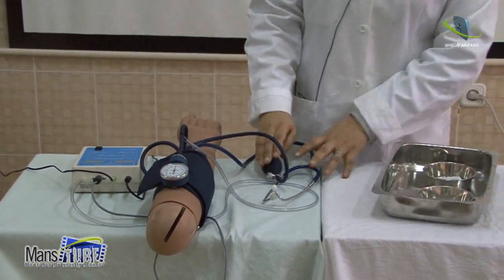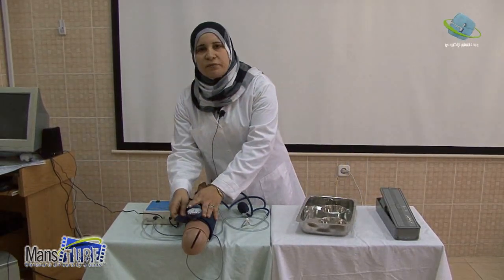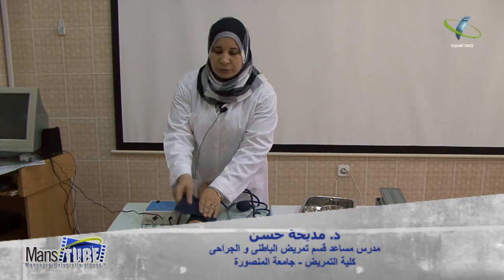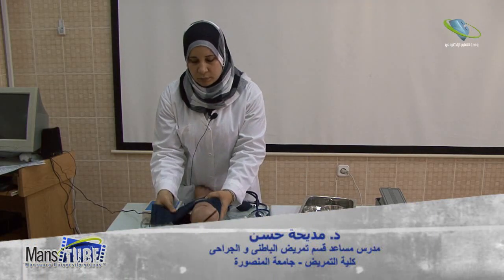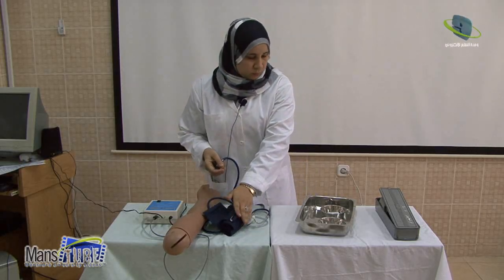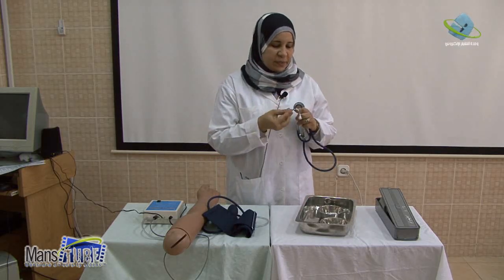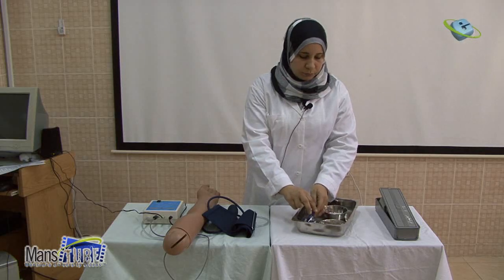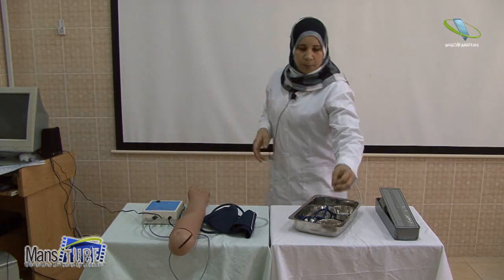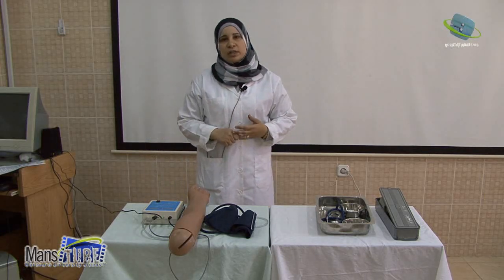Be sure the sphygmomanometer is at heart level and eye level for accurate measurement. Ensure the cuff is completely deflated to prevent pressure on the patient's arm. Then remove the sphygmomanometer. Disinfect the stethoscope diaphragm and earpieces to prevent cross infection. Return equipment and return the patient to a comfortable position, covering the arm. Document the blood pressure reading, including the date, which arm — right or left — and the patient's position.